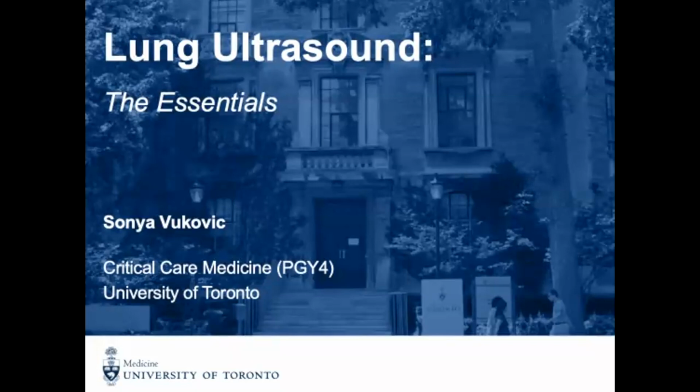So, as you mentioned, I'm going to talk about, in the cardiology world, the second most important organ, the lung. It's not quite like the Rolls Royce of echo, which is cardiac echo, but hopefully I can convince you a little bit today that it does have some clinical utility in your everyday practice.